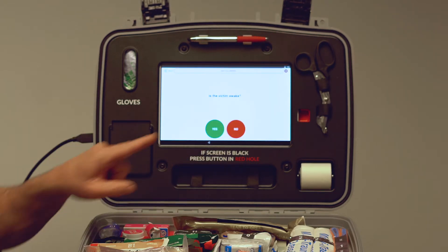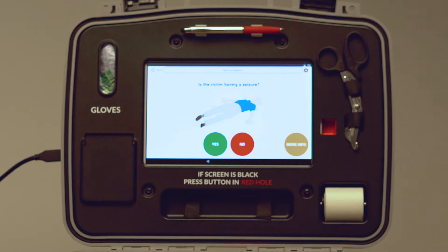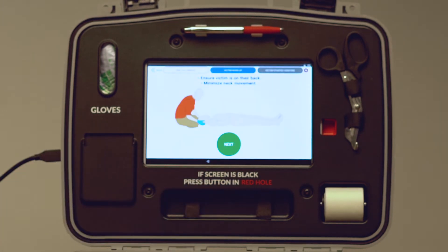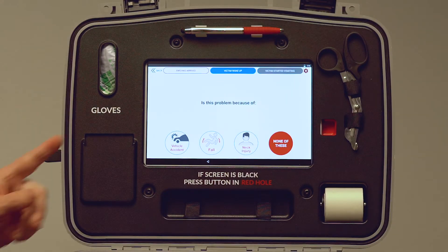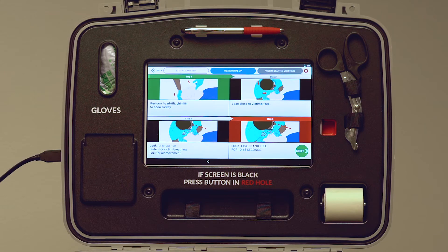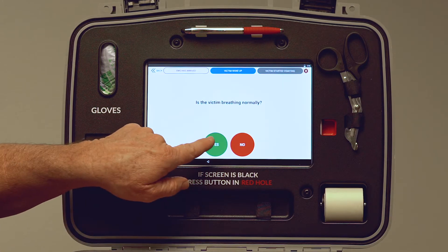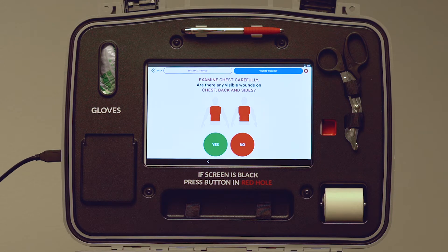Is the victim awake? We're going to say no. Is the victim having a seizure? As you can see, the system is covering all facets of potentially what could be happening to the victim. No. Ensure victim is on their back, minimize neck movement. Is the problem because of a vehicle accident, a fall, a neck injury, or none of these? We're going to choose the fall. It now says check for breathing, and again, we have a step-by-step procedure on what to do next. Is the victim breathing normally? Yes. Examine chest carefully — are there any visible wounds on the chest, back, and sides? As you can see, the Mobilize device helps you render aid to the victim step by step.